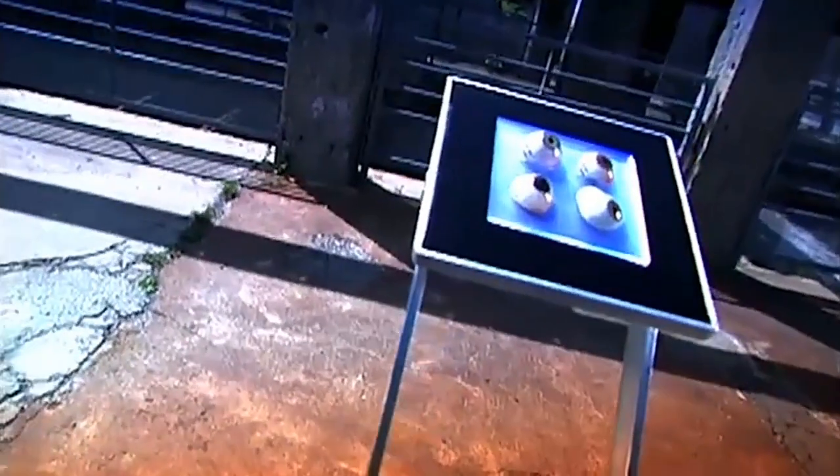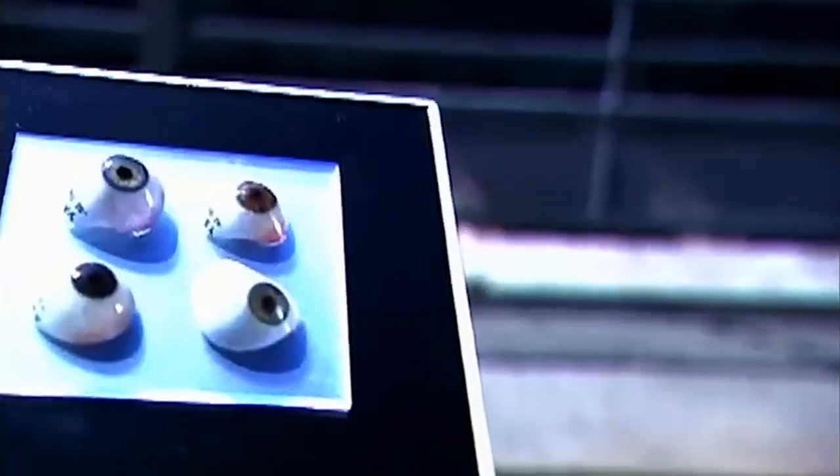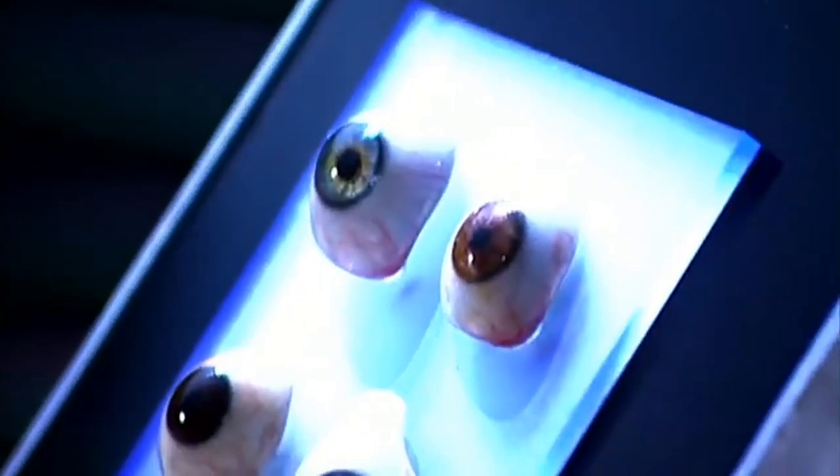The ancient Romans and Egyptians fashioned artificial eyes out of painted clay. By the 1500s, Europeans started making them out of enameled gold, and soon out of glass, which remained the norm for hundreds of years. Today, most artificial eyes are made of acrylic.